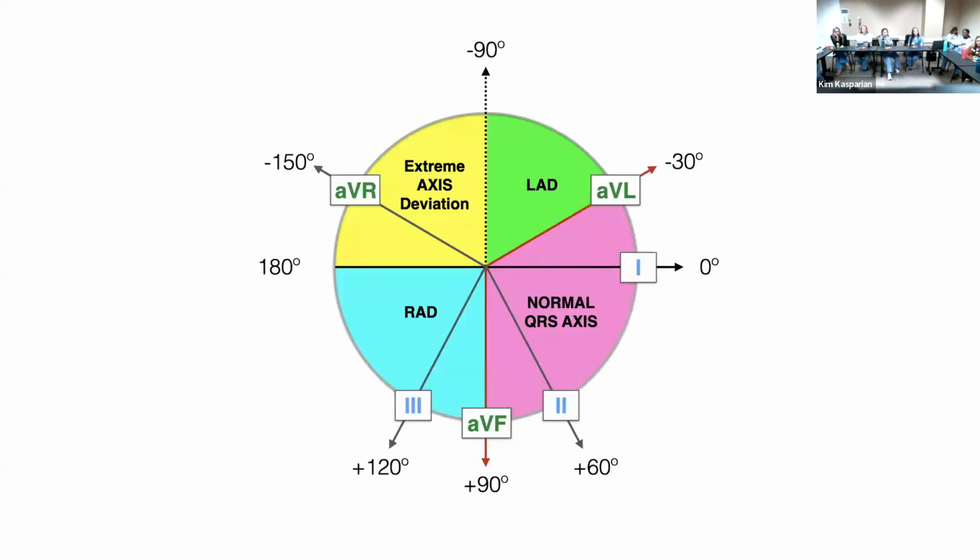All right, cardiac axis. So this is a pretty good schematic of the axis. So imagine placing this just directly on the center of your patient's chest. Okay, so the middle of this axis can be right there on the sternum, and that's your orientation. All right, so you have here some of your leads that you're probably familiar with seeing on the EKG. So 1, 2, and 3 are actual leads, and then the V's, those stand for virtual. So those don't correspond to an actual sticker on the patient's chest. They're calculated from the vectors that you get from these other real leads.